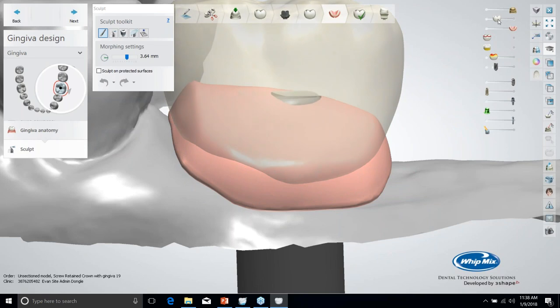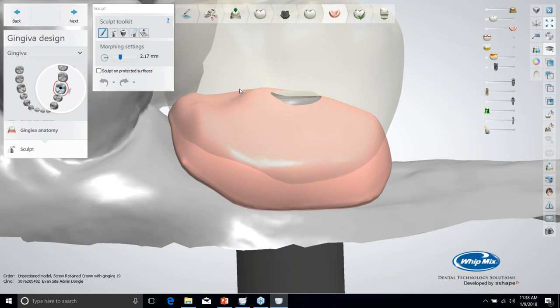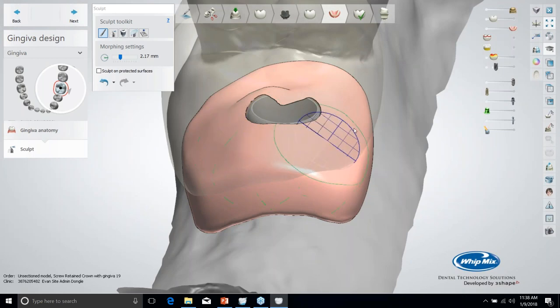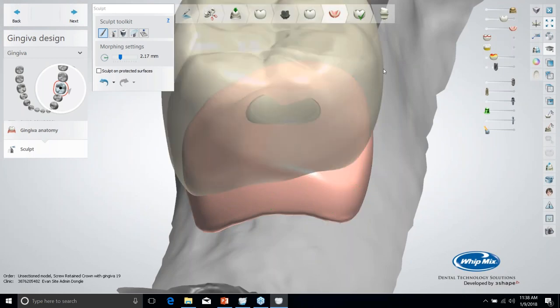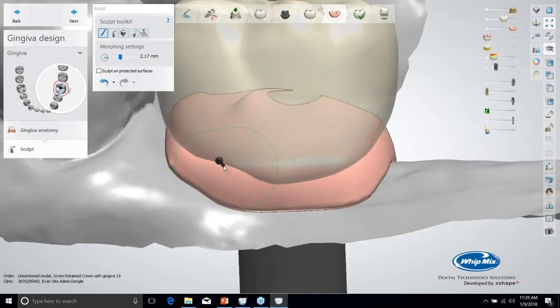You have the same tools that you have when you're sculpting a crown, except for the transform tool. So it's going to start out on the morph tool and you can just kind of morph this tissue, get it generally shaped the way you want. You don't have to be super concerned with the contour inside the crown because it's going to make them into the same unit. But what we want to do is work on this contour outside the crown.